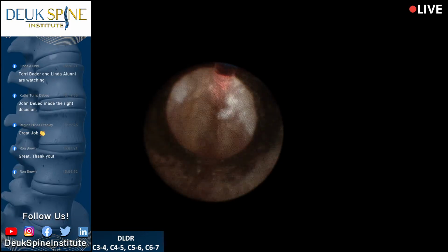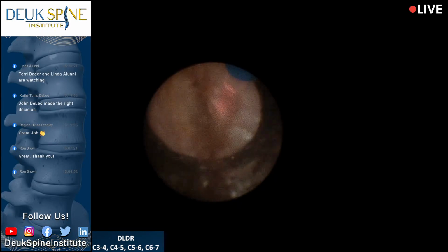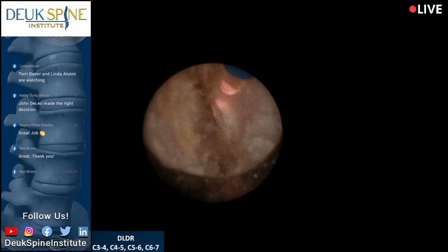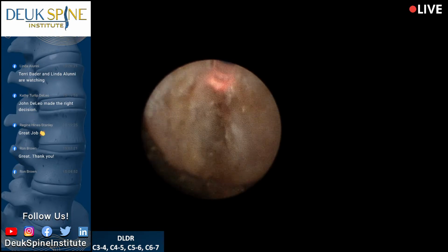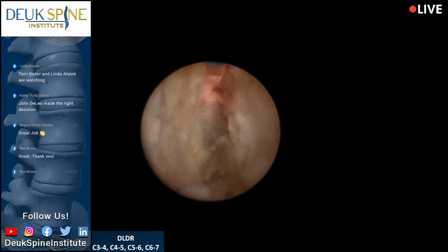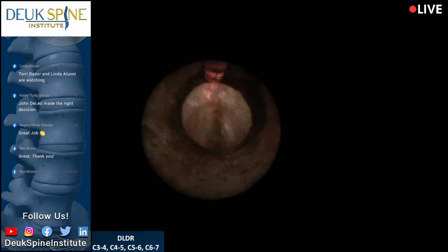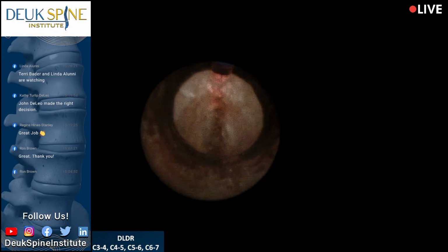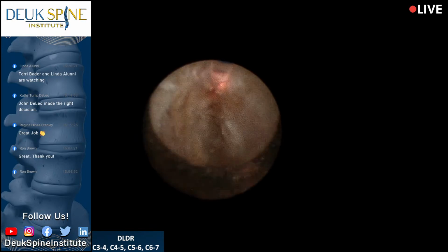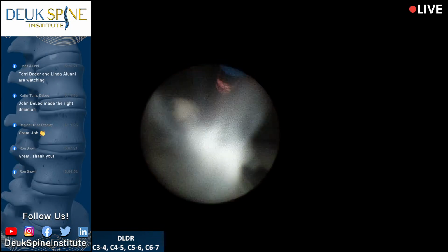This disc injury is really old. If I had to date it, I'd say at least 30 or 40 years old. So this is not responsible for any of his newer symptoms. It's one of the advantages of doing the surgery. I can go inside the disc and I can actually see how old the injury is. You got injured a lot in football, you said 30, 40. This is that football injury. This is the football part.